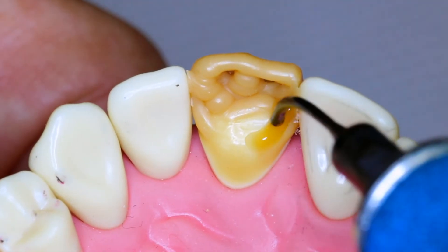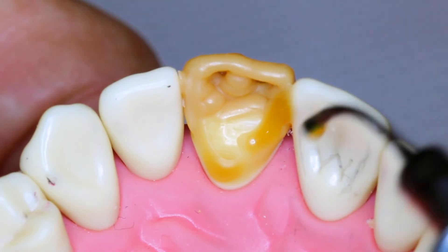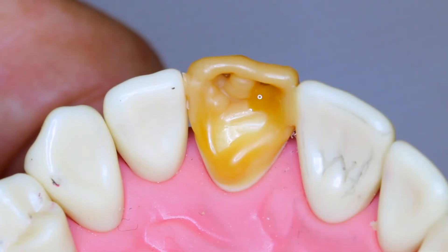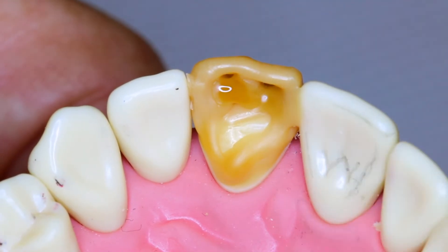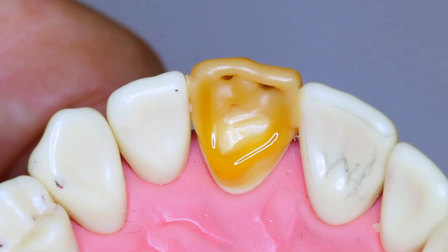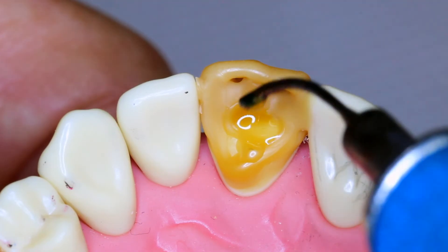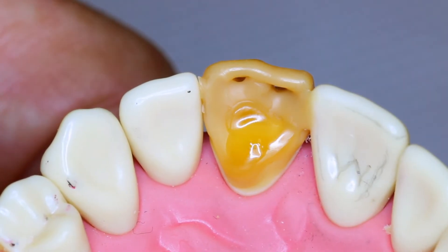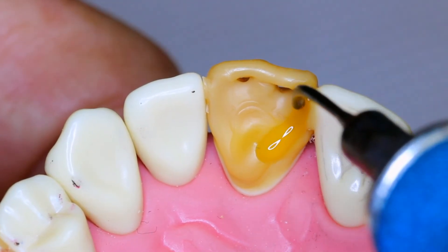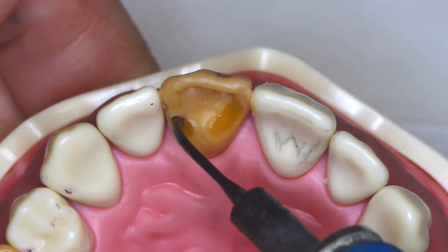Going to the lingual aspect, we will start developing lingual marginal ridges. Marginal ridges mirror the adjacent tooth and will be used in occlusion if the adjacent tooth has occlusion — this is what we will check when we close the typodont. We continue developing the lingual aspect by adding a cingulum. The cingulum is more distal lingual than mesial lingual; this will help you place it. We continue adding two marginal ridges and line angles to develop the contour.